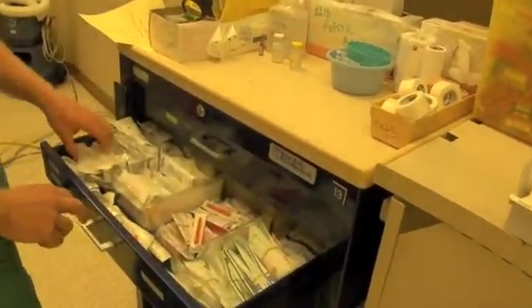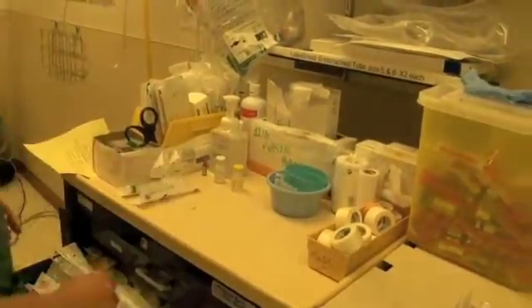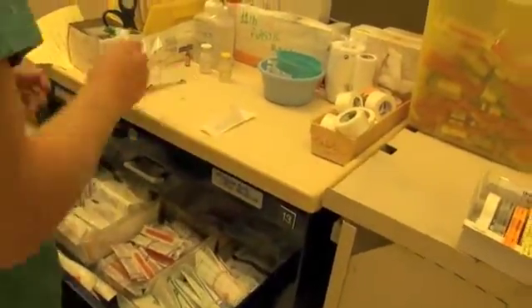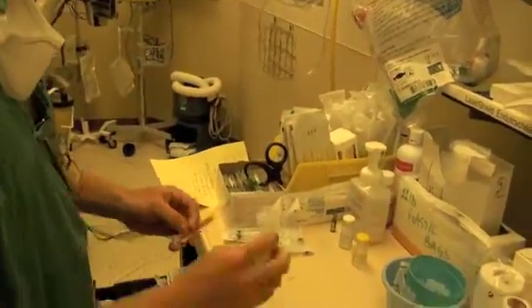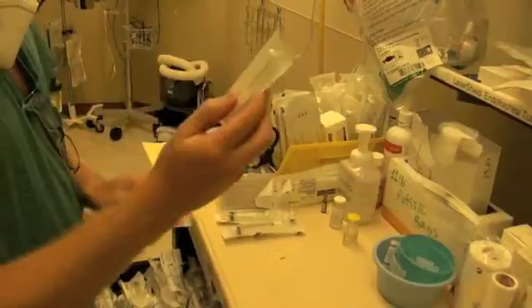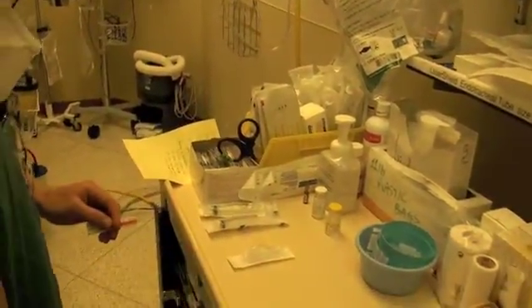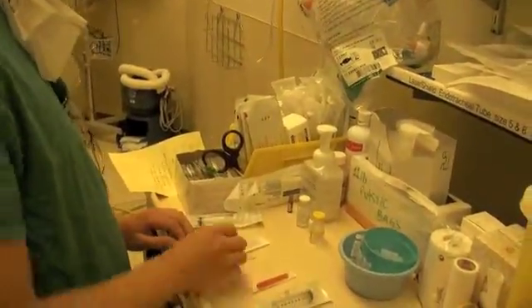Now we'll get syringes — a couple of 10 milliliter syringes — and we'll get needles. I'm going to be using the blunt-ended needle for the demonstration today, but note that there is also a safety needle, which we can pull out and play with towards the end of the video. We want to make sure that we are careful to maintain sterile technique.